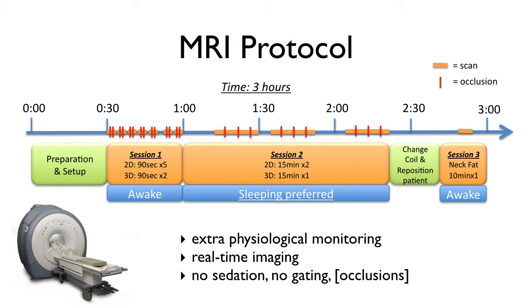We facilitate sleep by doing a prior mock scan to make sure they're comfortable and don't have claustrophobia issues. We also start the MRIs at 9 p.m. and ask the patients to go on caffeine restriction for a day. And we also built a memory foam bed. One of our early aims was to actually change the MRI gradients so that they're quieter, but we found that was practically impossible, and we published a paper on that in our top journal.